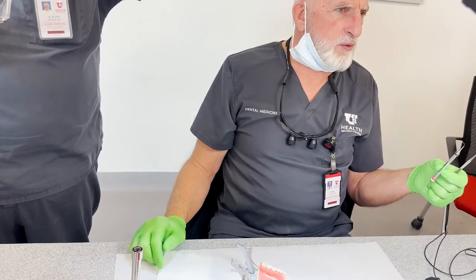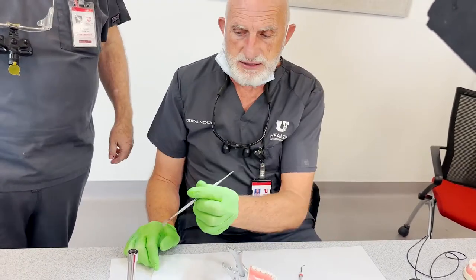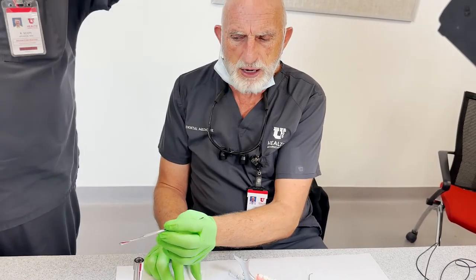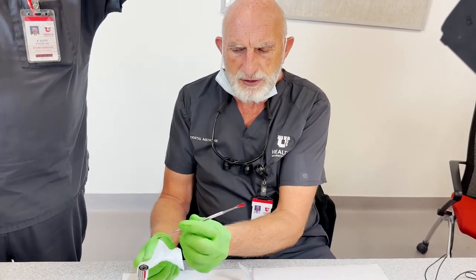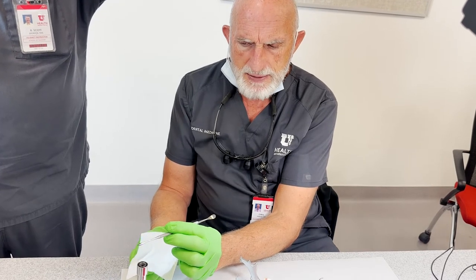What I like to do when I start is make sure all my instruments are clean, because I don't know who's been using them. I want to make sure the wax that I'm putting on is what I want. So I'm going to go ahead and heat those, wipe them off either with a paper towel or a gauze pad, okay?